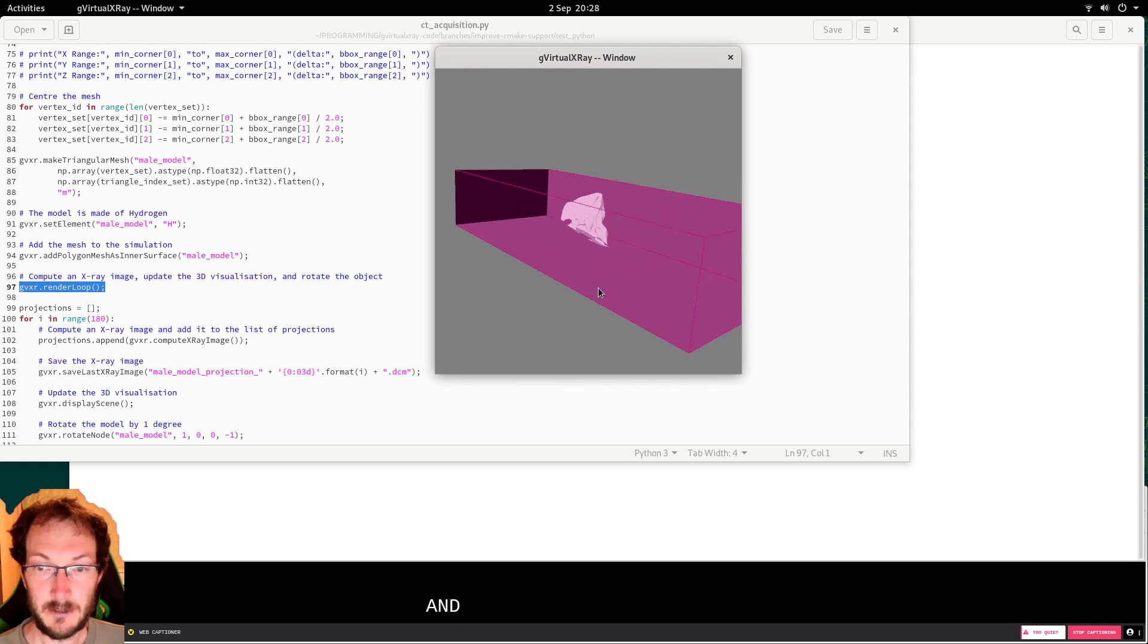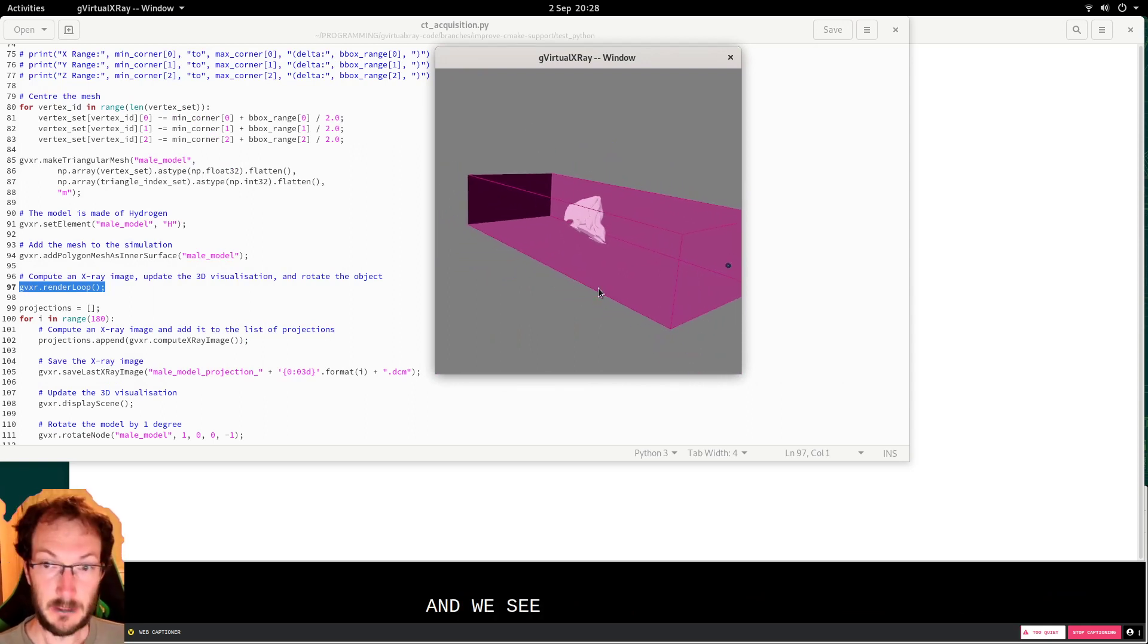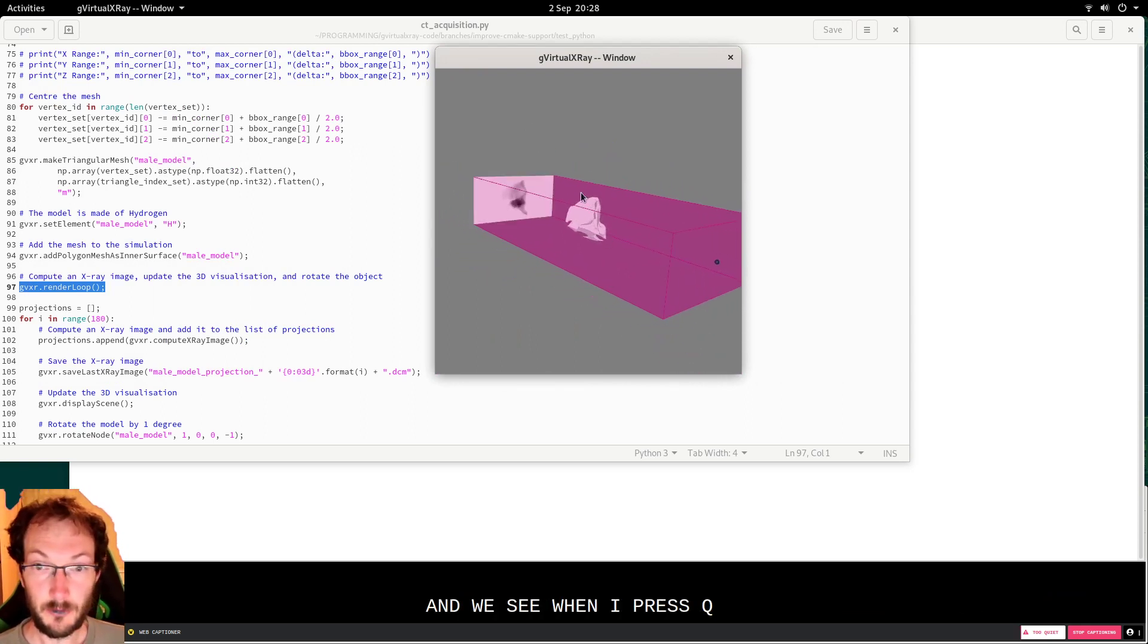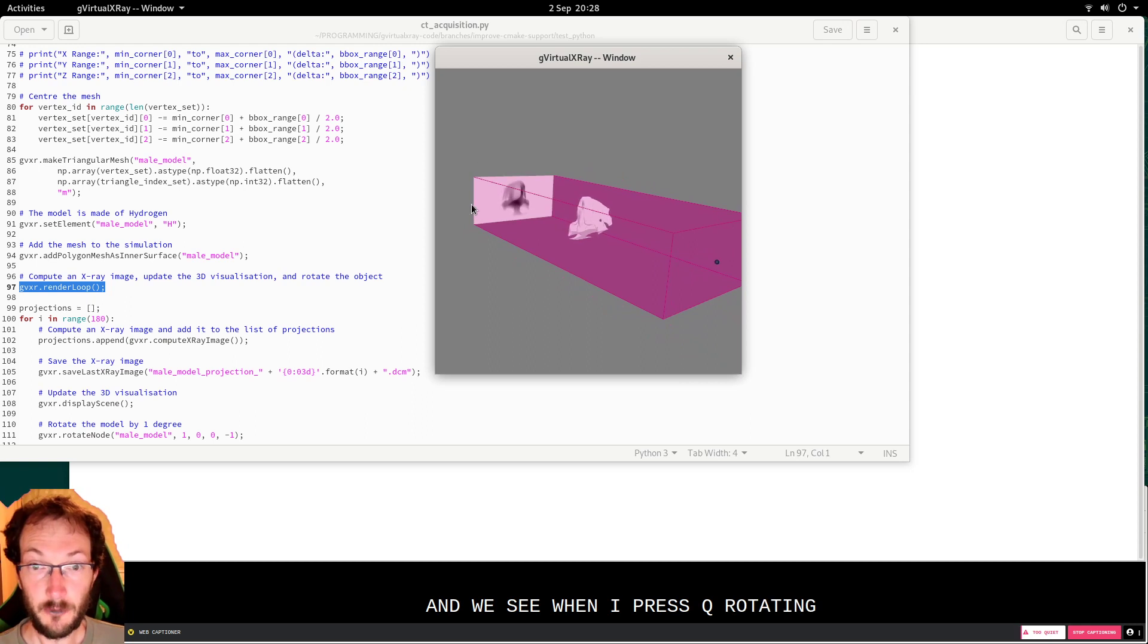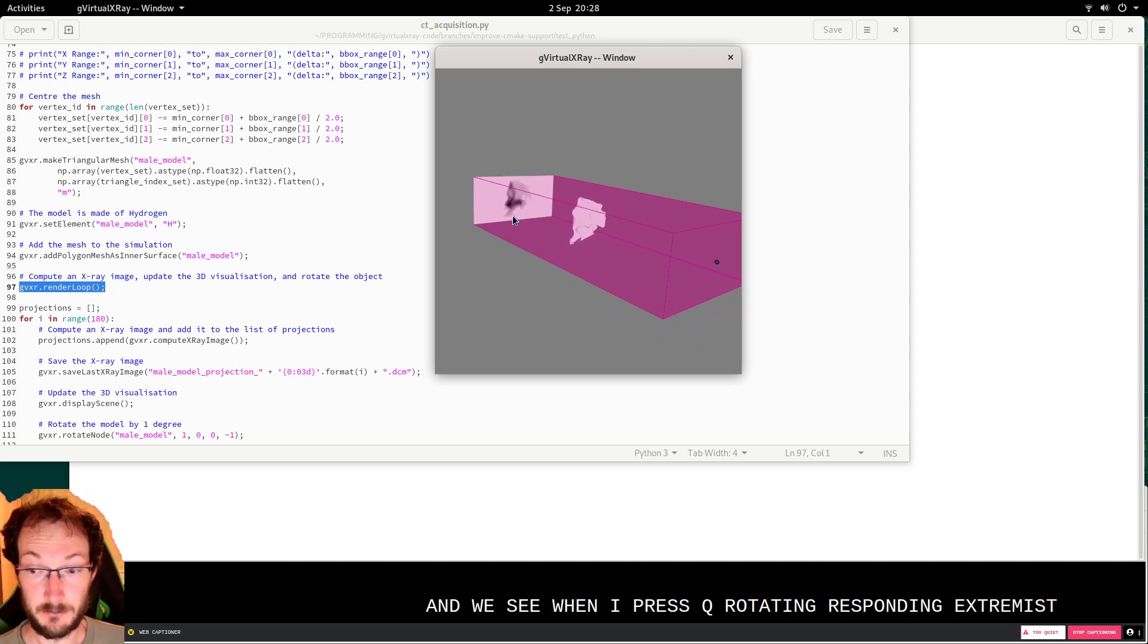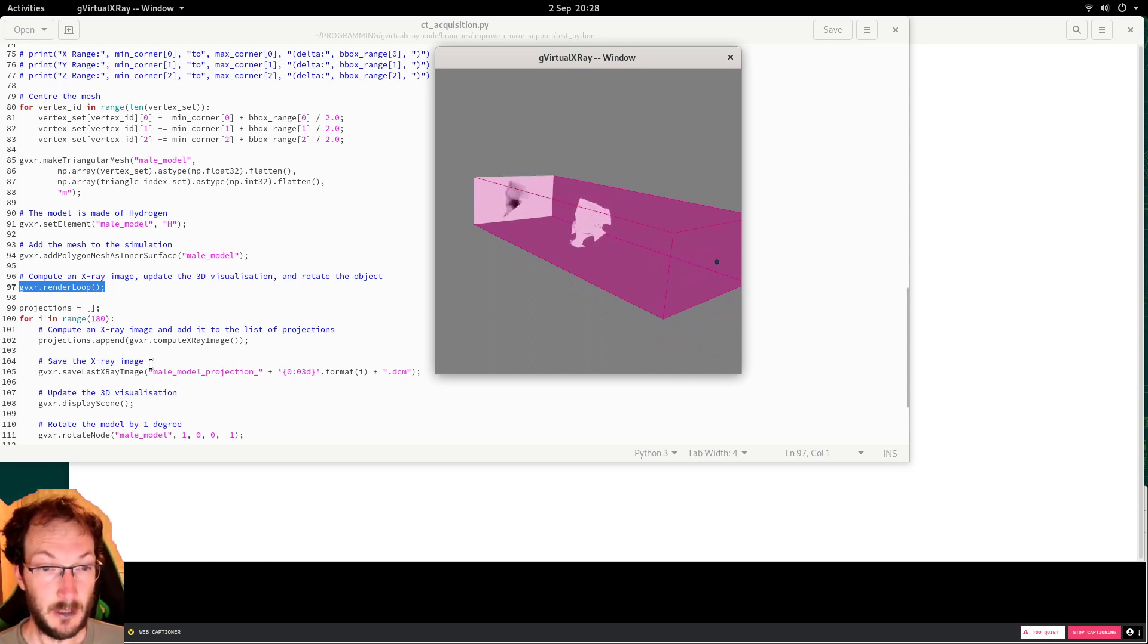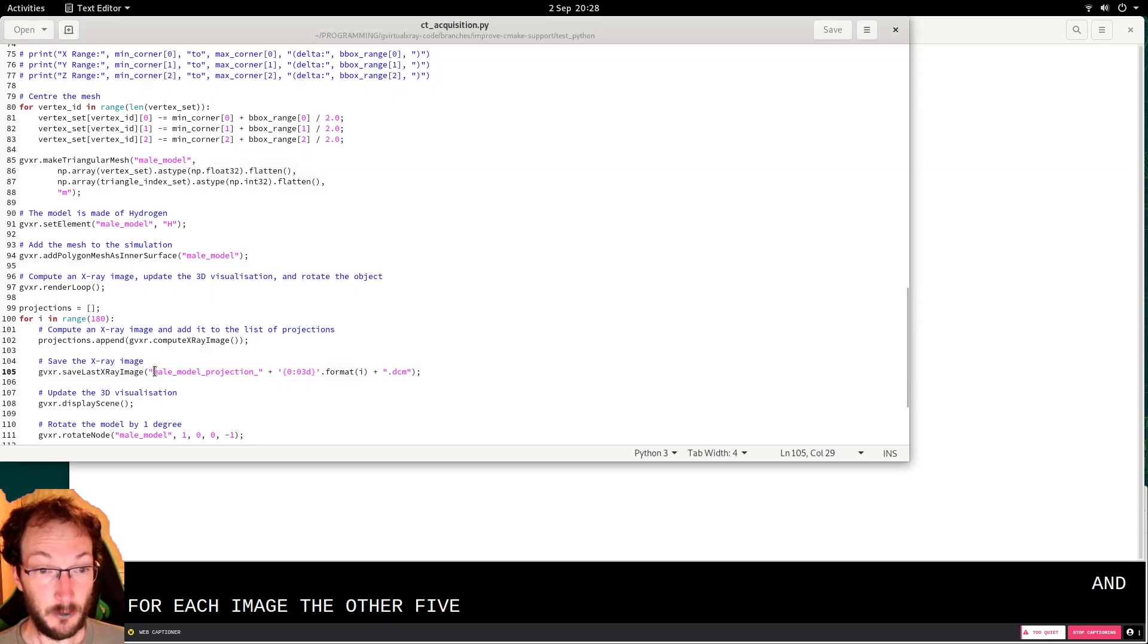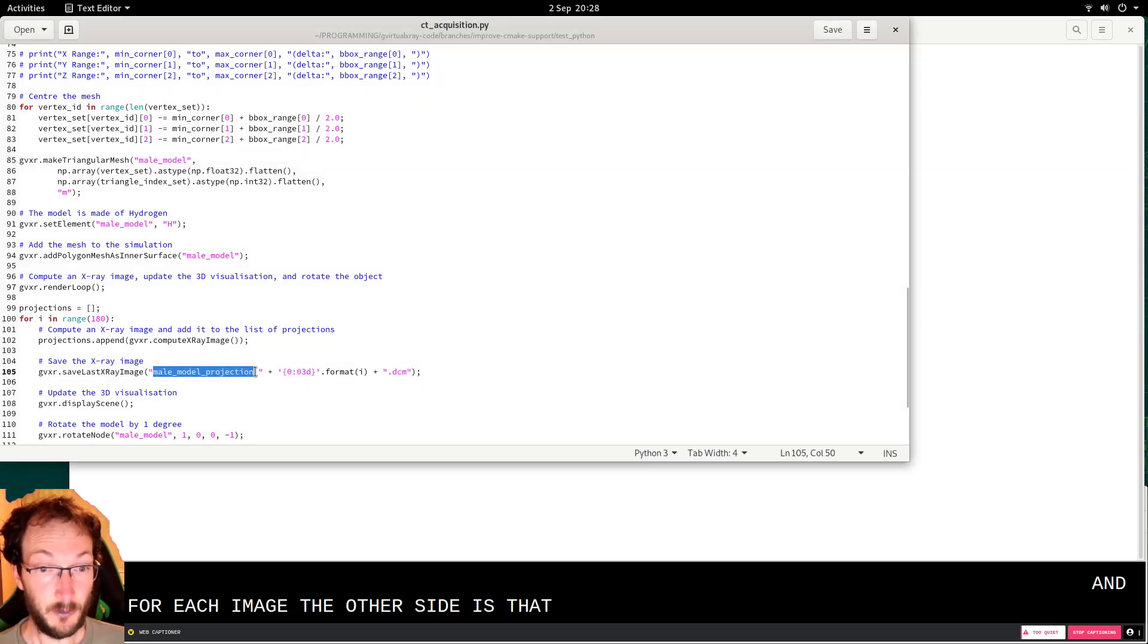And we'll see when I press Q the model rotating and the corresponding x-ray image. And for each image we have a file with that file format for the name.